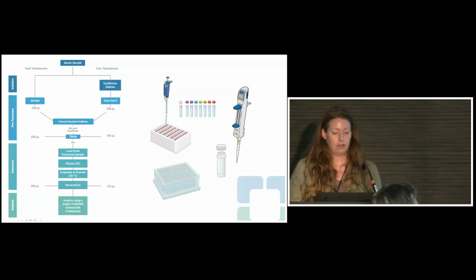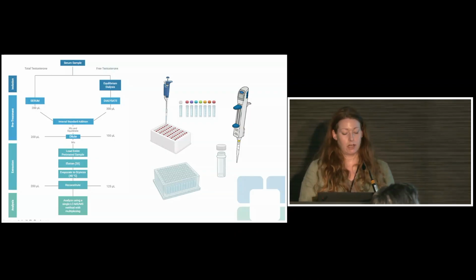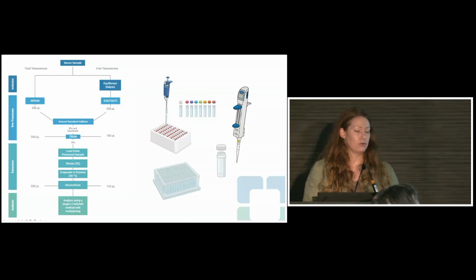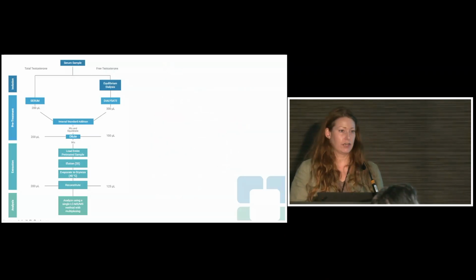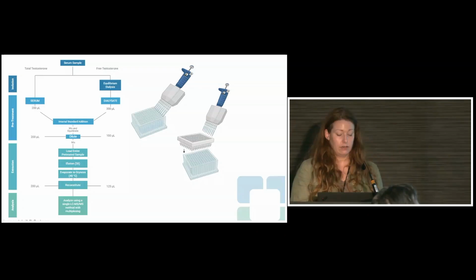I'd like to note here that we're using the same internal standard concentration, same internal standard solution, and this also helps the bench. We prioritize single-use aliquots to really reduce the chance of contamination, and it's just a little easier to not have to keep track of one bottle. You have a rack of things that you can use, and if you spill something, you can just grab another aliquot. It's not like you have to make a new internal standard solution. So after we add the internal standard and we acclimate the IS with the sample, they get diluted with water.